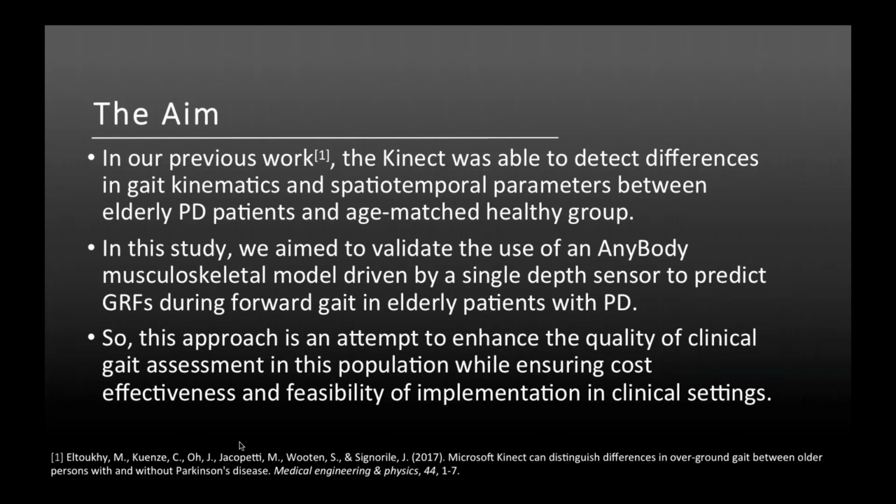So first, we wanted to make sure that the Kinect or depth sensors are sensitive enough to measure kinematic differences between healthy and PD patients to start with.